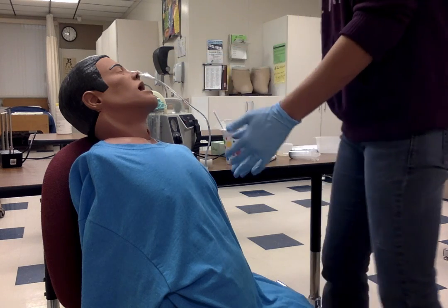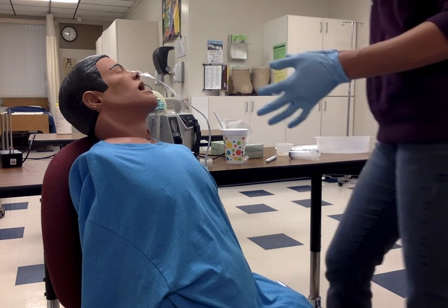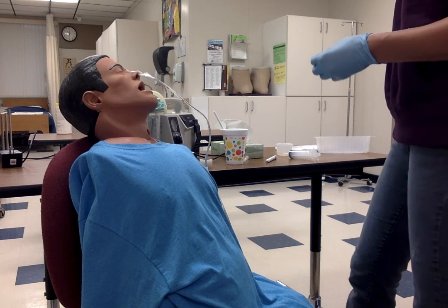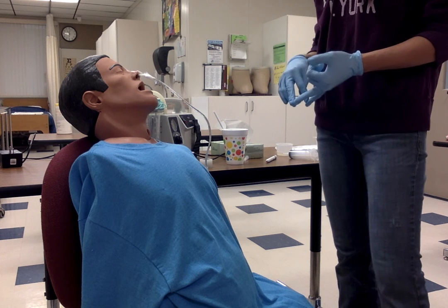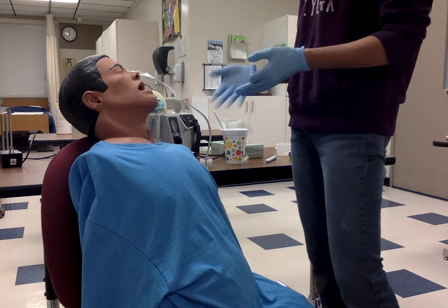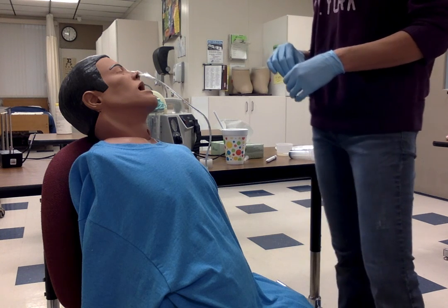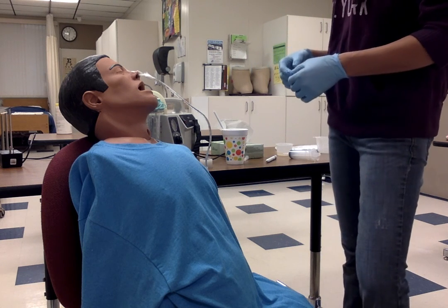So now we have suctioning going. We have explained to the patient that it's suctioning now. You should have relief of symptoms. One of the big things you want to do is documentation. You can document that you have the NG tube placed. You'll want to document how the patient tolerated it. You'll want to document what you aspirated. If this fills up really fast, you'll want to empty this out, document the color, and all those types of things. Then this is where you would go ahead and place your x-ray order.